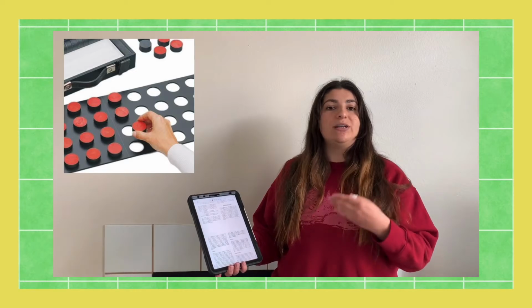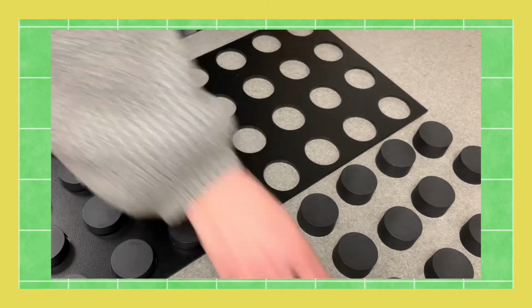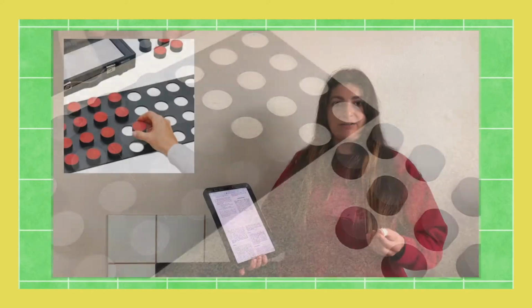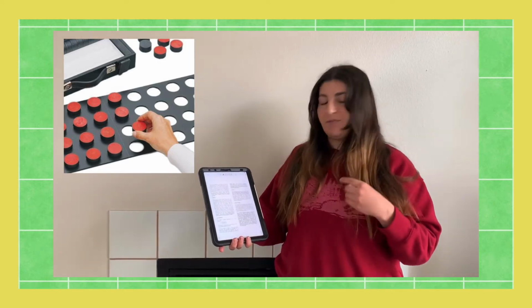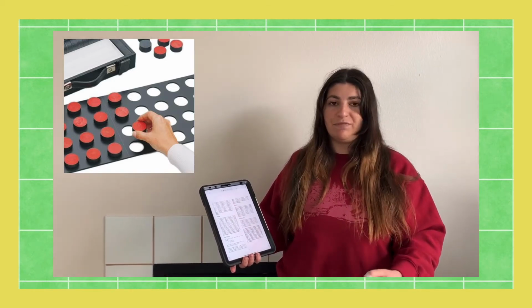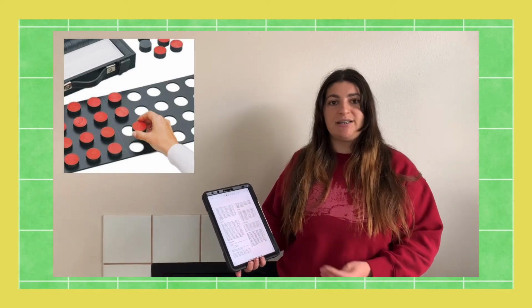Another thing is that you need to give the patient a practice trial after explaining the 2 tests to them so they can practice before taking the 4 trials that are needed to calculate the scores for the baseline assessment. Another thing to keep in mind is if you are able to do a group testing with a bunch of other patients, because this encourages motivation and competition, so it encourages the patient to try and finish the test at a faster time.